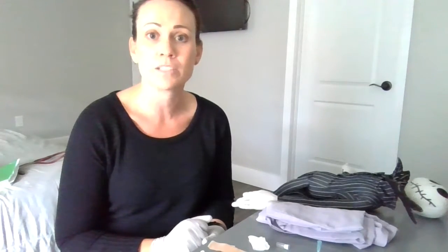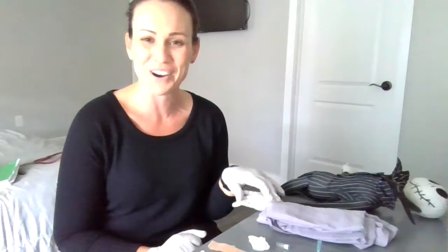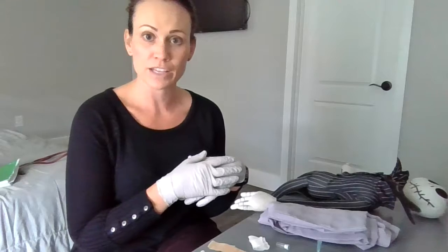So the first thing I need to do, it's a little bit different than when the nurses draw blood. I can't use the blood sample that they just took from you. This is from your artery, not your veins that the nurses use. So first thing I need to do is check your arteries and make sure that there's a good collateral return. So if you don't mind, I'd like to take a look at your wrist and check that.